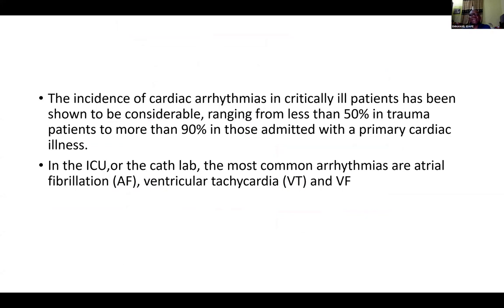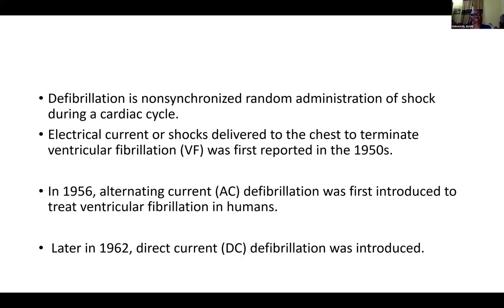The incidence of cardiac arrhythmia increases critically, especially in the ICU or in the cath lab. We frequently encounter them during PCI and during cardiac device procedures. I've recorded some cases in the cath lab where we were doing a CRT, and in the process of positioning the lead the patient went into ventricular tachycardia, and we had to shock that patient immediately and continue with our procedure. So we encounter them from time to time in the cath lab. Defibrillation is a non-synchronized, random administration of shock.